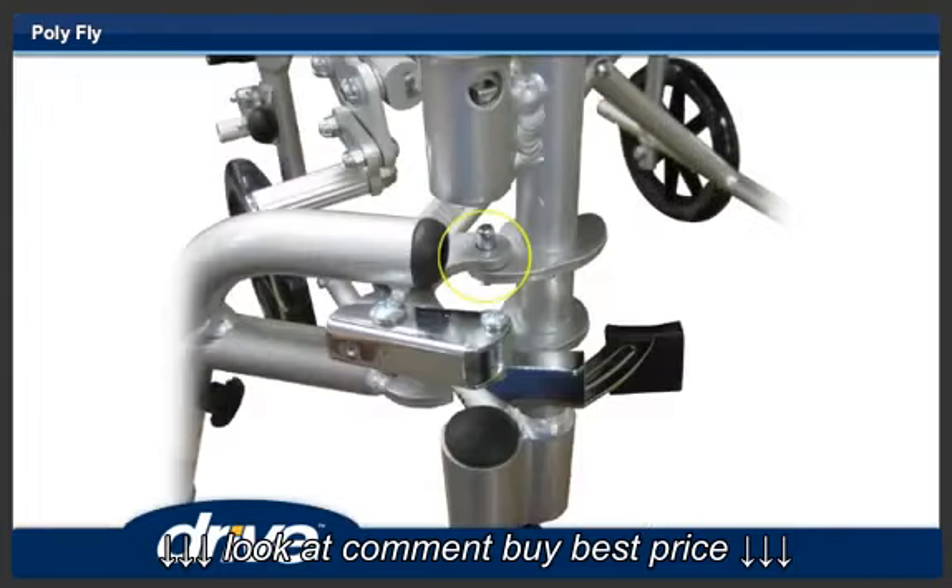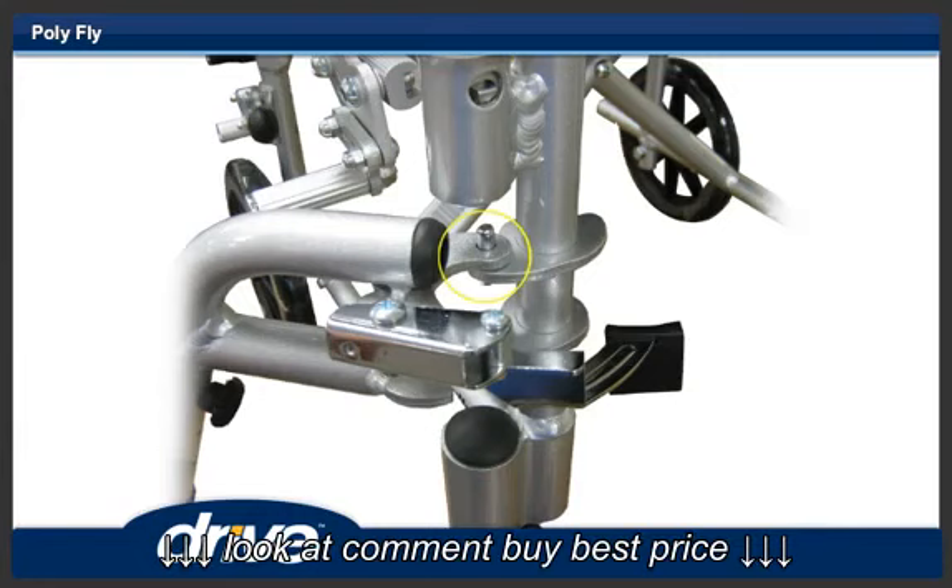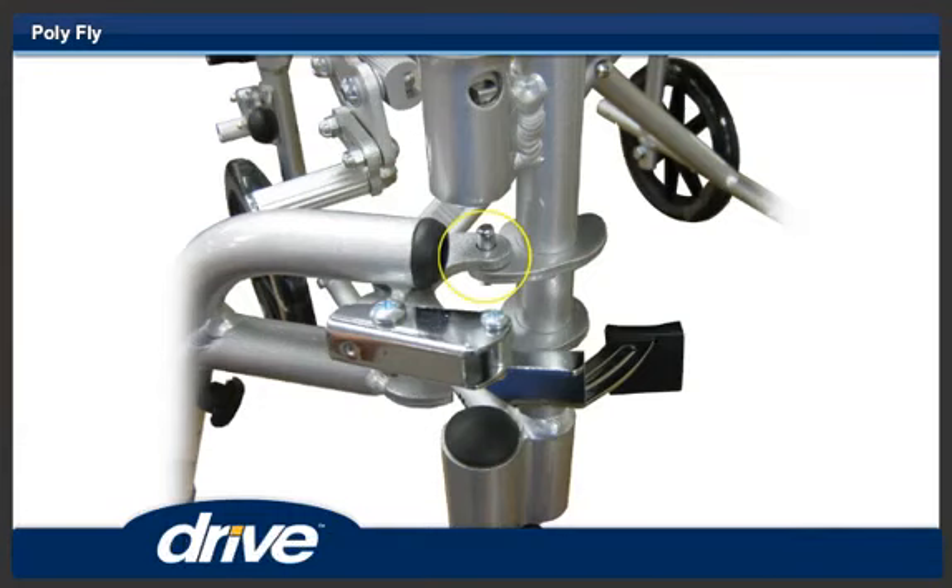Step 5. To install the footrest, align the two holes on the footrest hanger with the hanger pins on the front frame of the Polyfly and let the hanger rest on the frame hanger bracket.